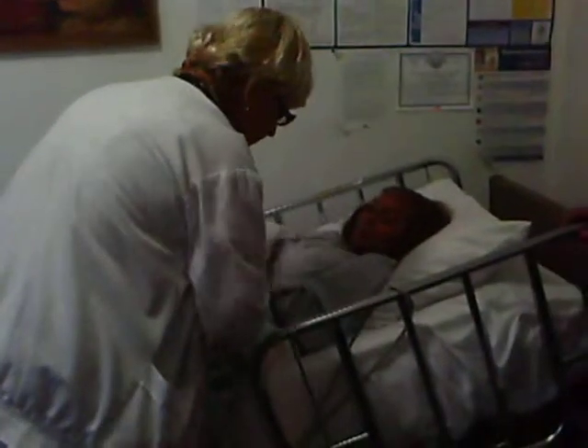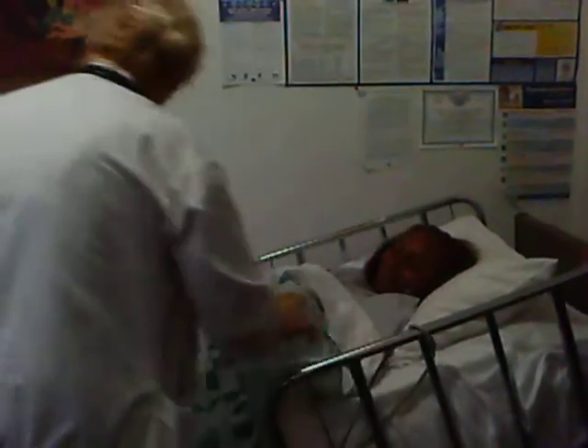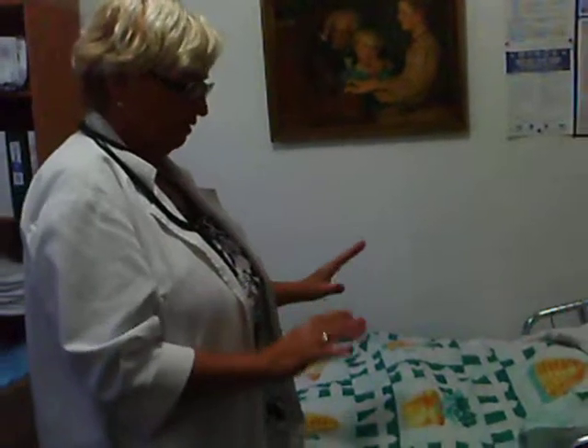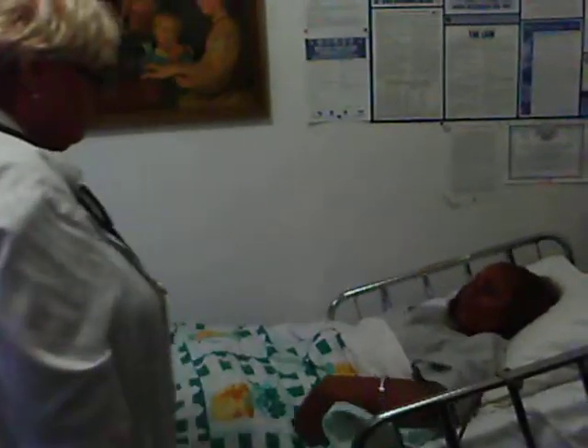Let me check the scale — this is green. How are you? This is okay. I am going to wash my hands, bring the supplies, and I will be right back. In the meantime, let me give you the call light, just in case you need something. Are you comfortable in the bed? Yes.